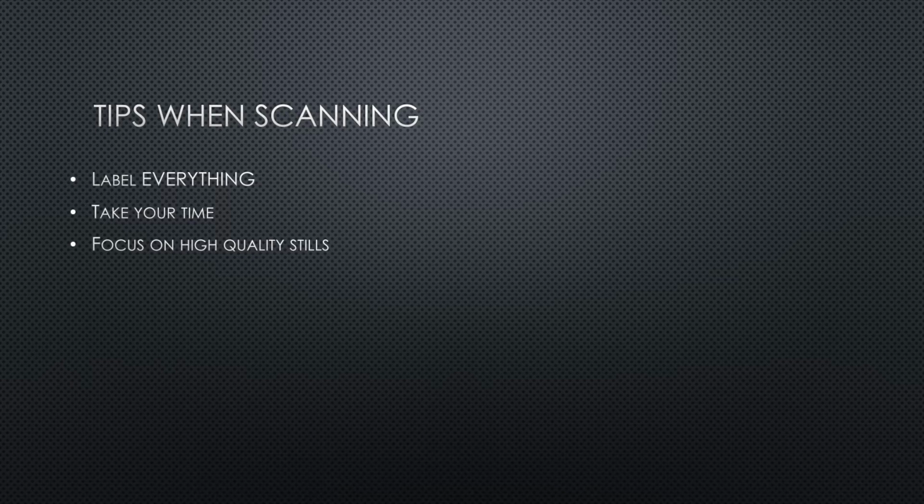Now we are configured to send stills and clips, but because I want you guys to be able to go anywhere and do this, I want you to have practice in doing stills. So generally speaking, unless we're imaging a moving structure, we're probably mostly doing stills if you're scanning with me, and that's what I'm trying to instill in you guys to get into the habit of doing. And honestly, that way it makes you sort of commit, right? This is the image that I think is the best that shows what I'm trying to show. Whereas with the clip, you can be like, I think I got it there.